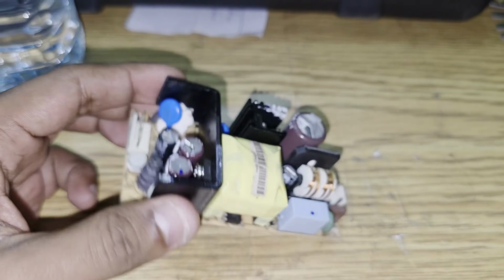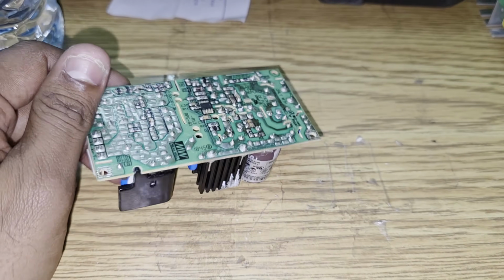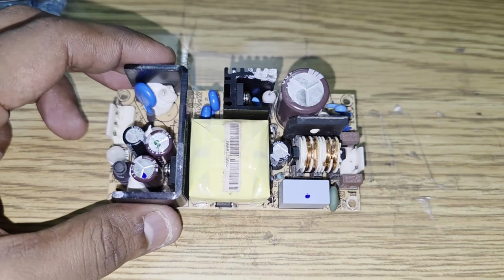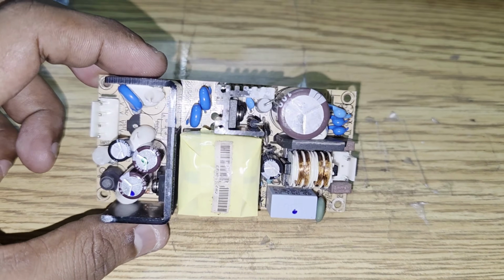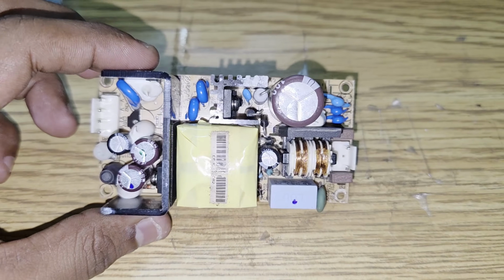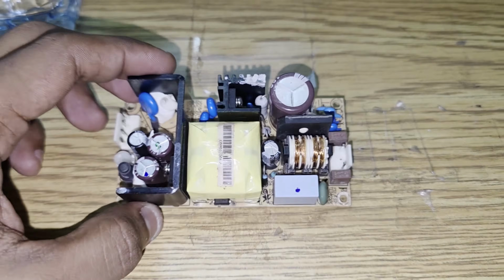In this video we are going to see about a power supply board which is giving 24 volt out and 230. It is like a regular video, because I did a lot of videos about the power supply board, but still I'm once again doing a power supply repair. So let's do it.